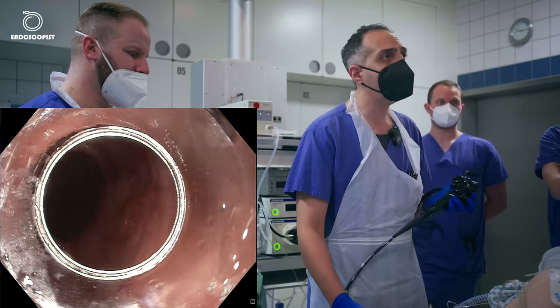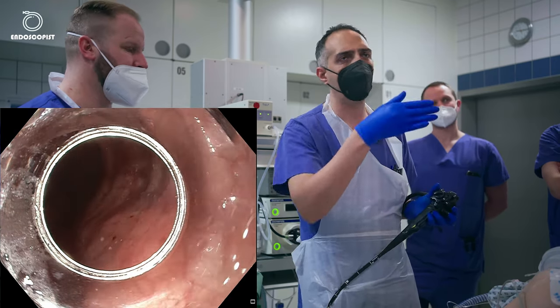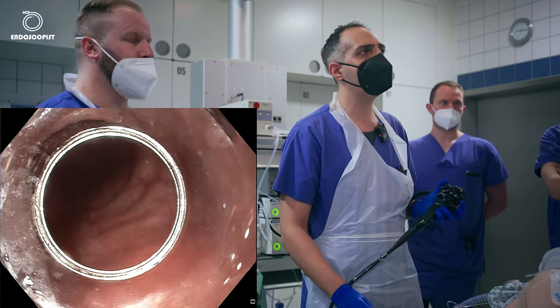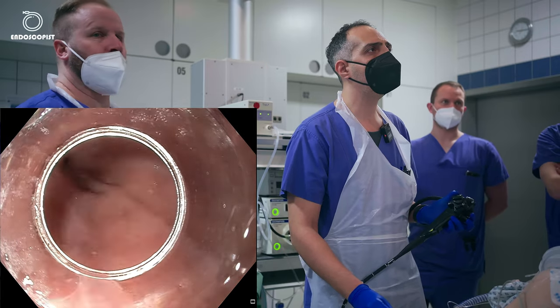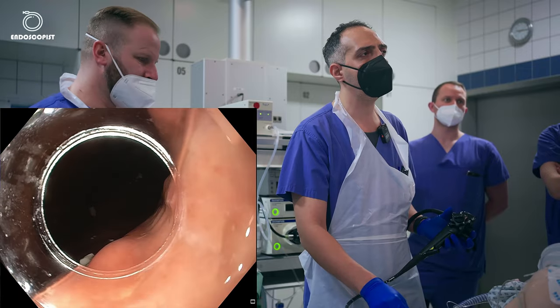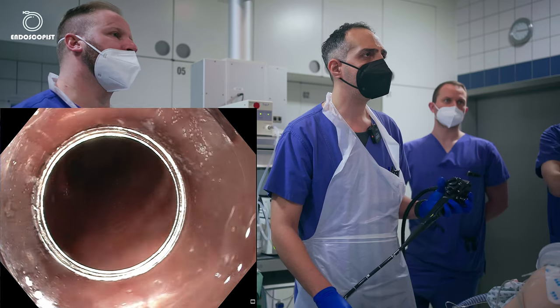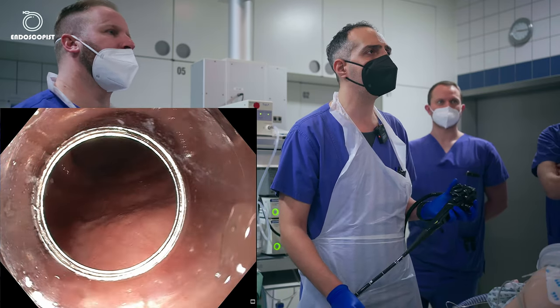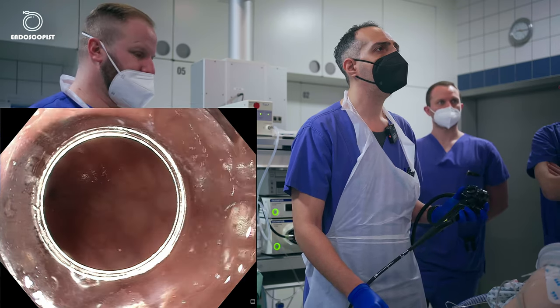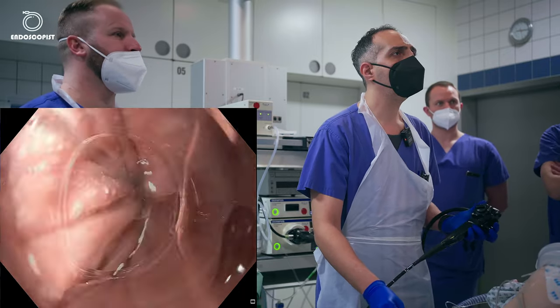Something like here. We'll start our tunnel here, and our technique is to start by 5 o'clock. We'll do an opening in the mucosa, a small incision, then we'll do the tunnel downwards, and we'll try to go for about 2 centimeters below the cardia. And after we finish the tunnel, we'll start doing our myotomy. It's very important to observe the mucosa to make sure that everything is intact. So the mucosa looks fine. I will just clean it again.